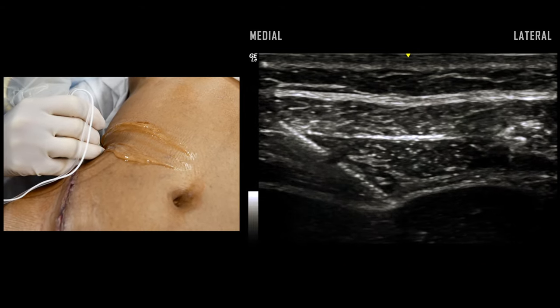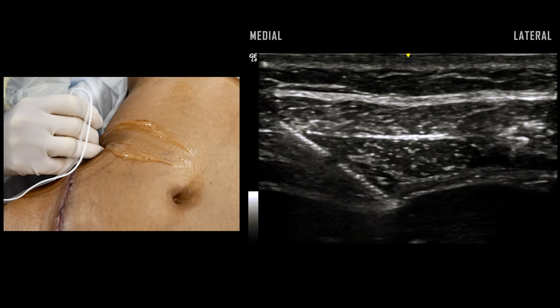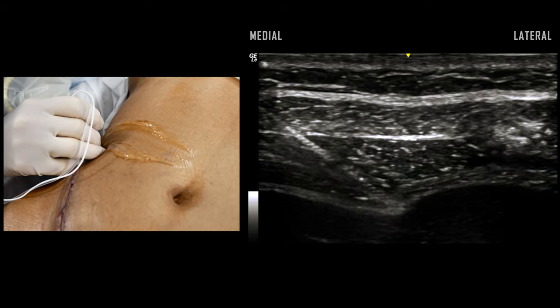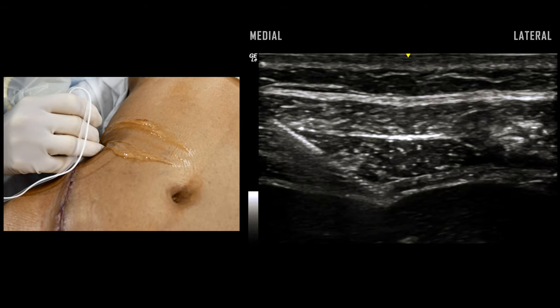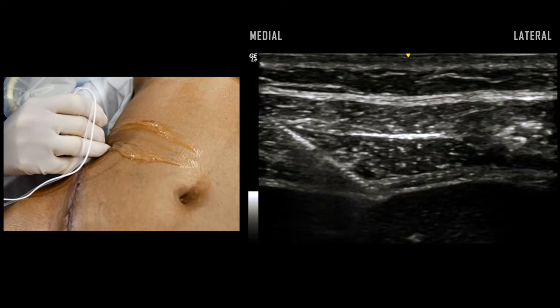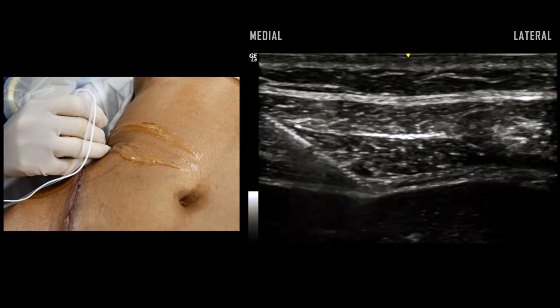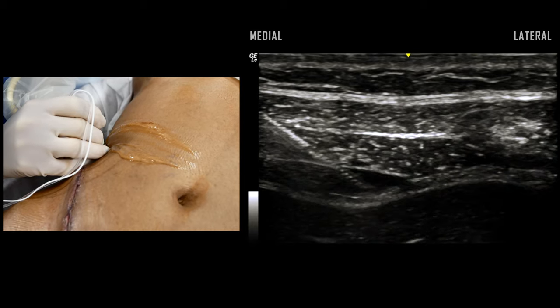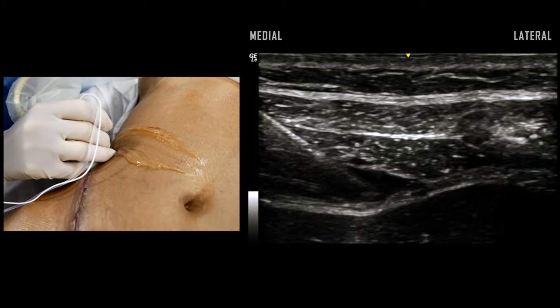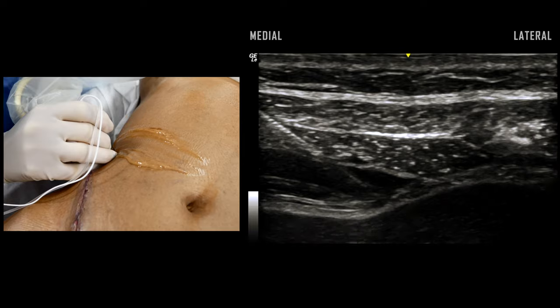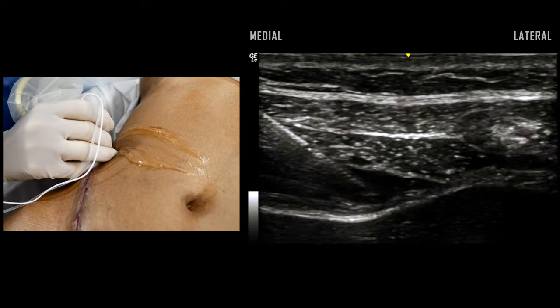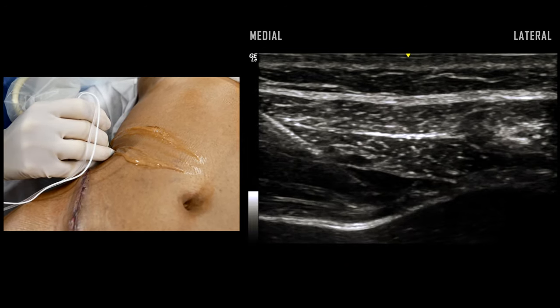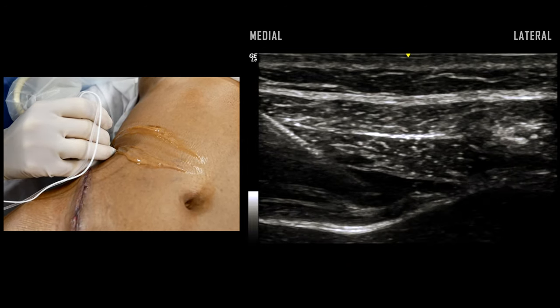With additional advancement of the needle tip and an additional pop, the needle has now entered the plane between the internal oblique and transversus abdominis. Injection of local anesthetic demonstrates the clear bidirectional separation of the two layers, suggesting deposition in the correct fascial plane.